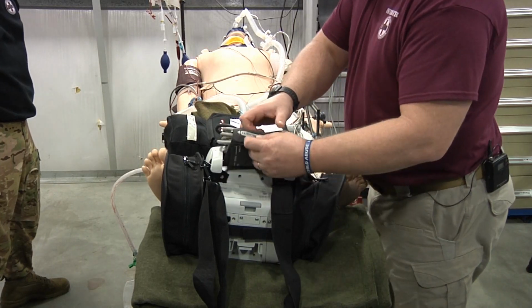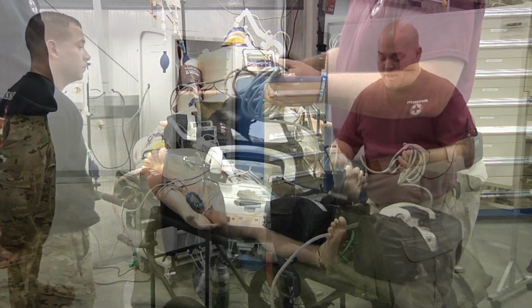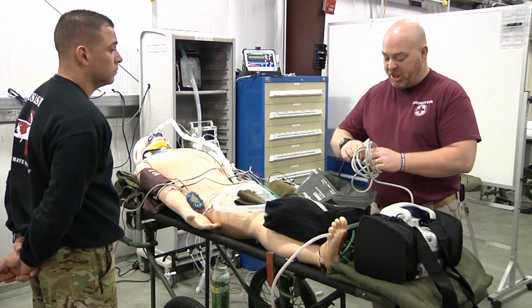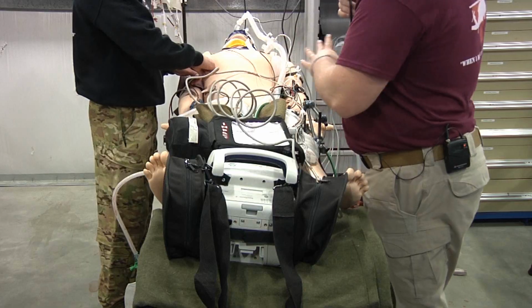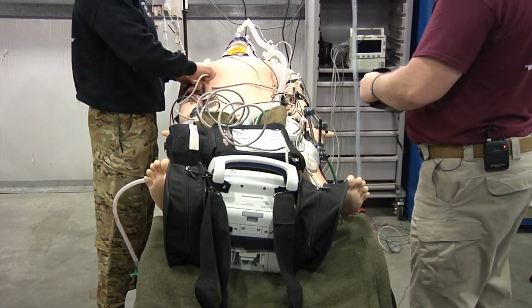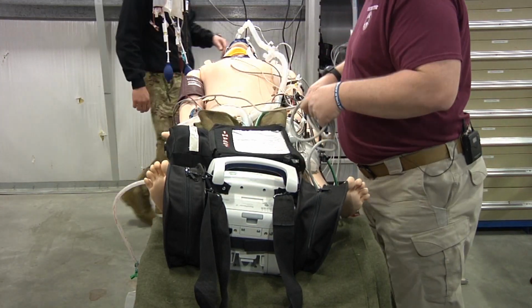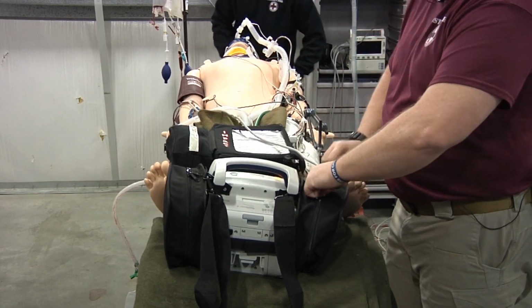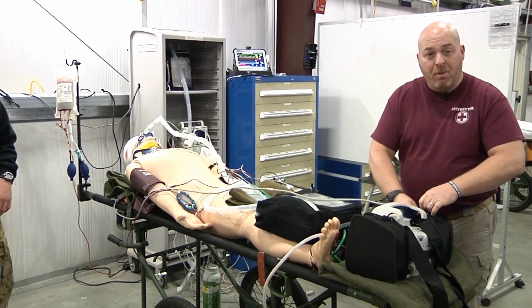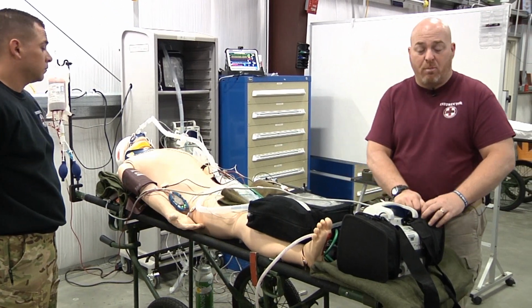Okay. If your patient has a blood pressure cuff that is compatible with your monitor and the facility doesn't mind exchanging, you can just exchange cuffs with them, hook up the cables, give them your cuff, you get their cuff, and then take your extra blood pressure cuff cable and put it back in the monitor bag as well. The more you can put back in the bag, the better off you'll be. The easier your patient will be to manage.